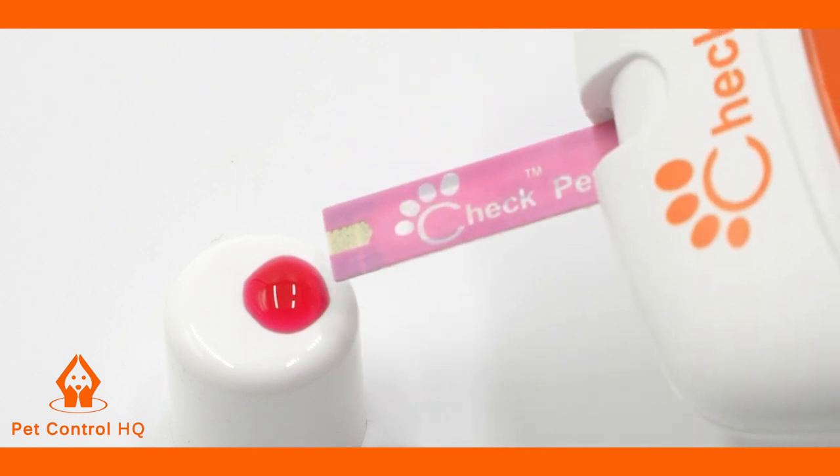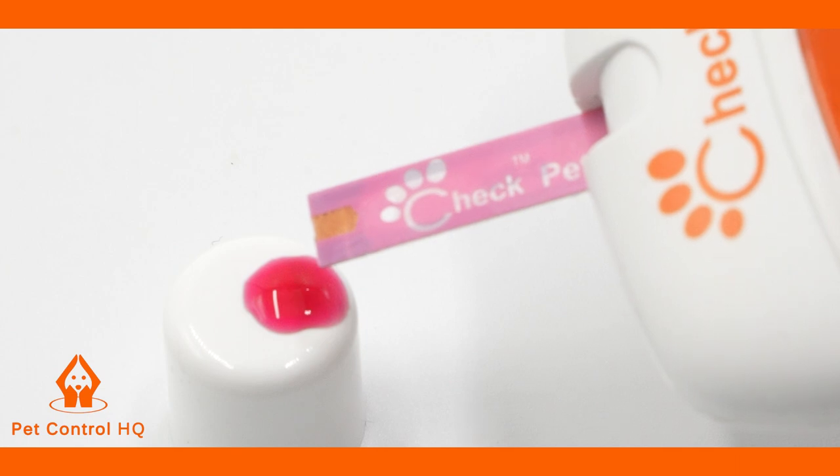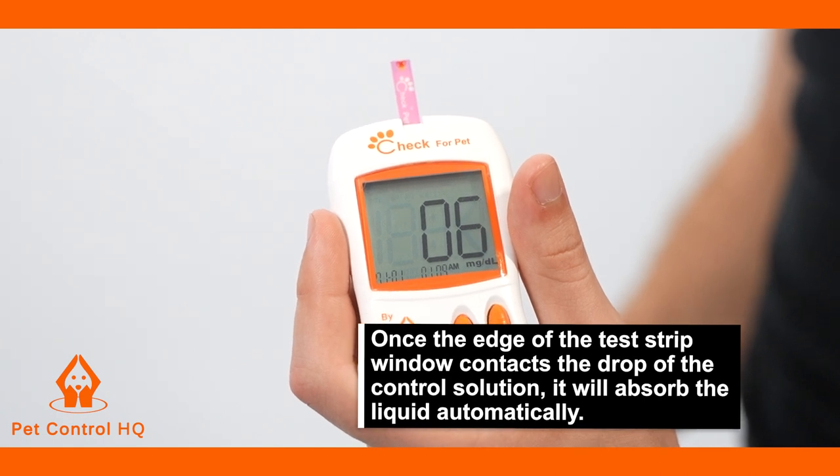If using the cap, lean the test strip window to the drop of control solution on the bottle cap or on your fingertip. Once the edge of the test strip window contacts the drop of control solution, it will absorb the liquid automatically.